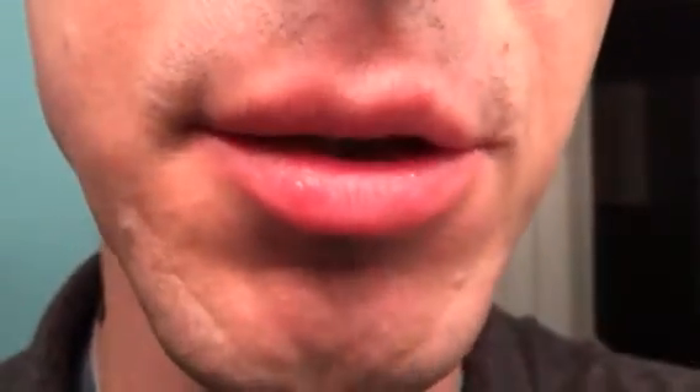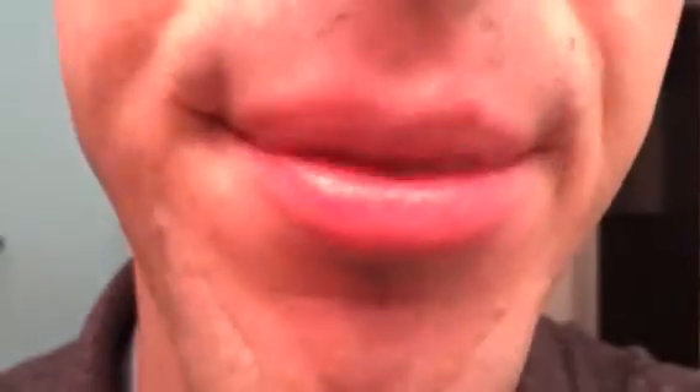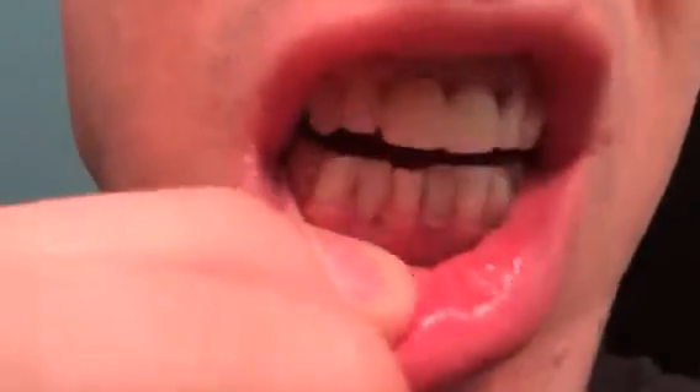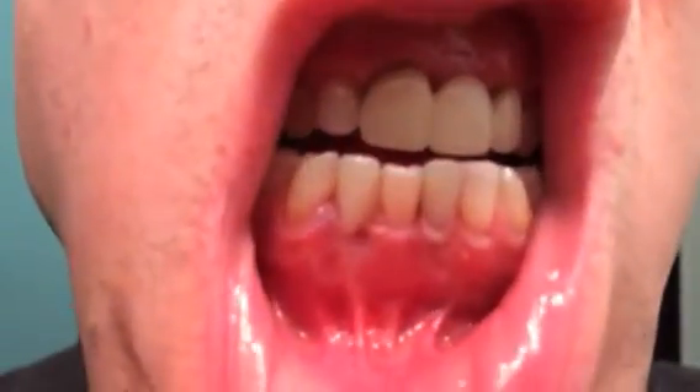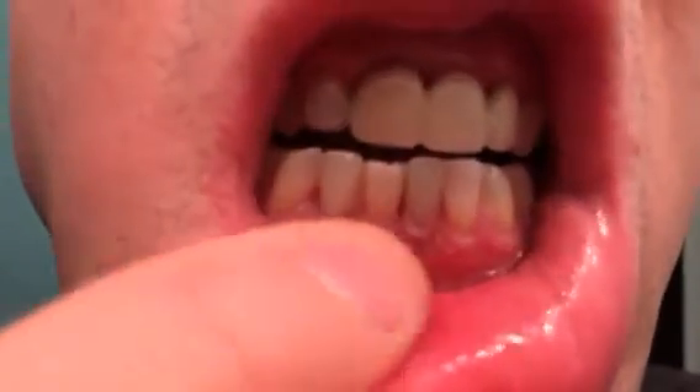I had my two lower teeth extracted today. I have a flipper in right now — this is one tooth and this is the other, and this is the flipper.